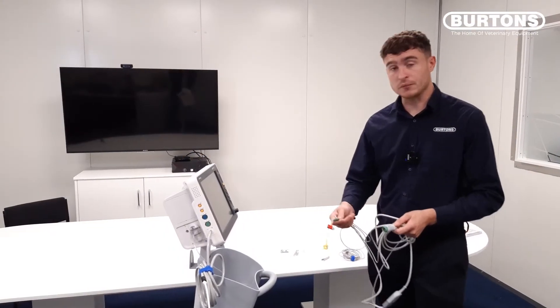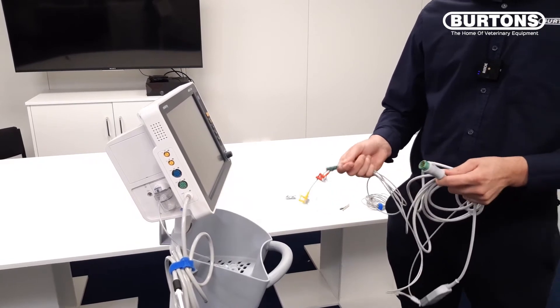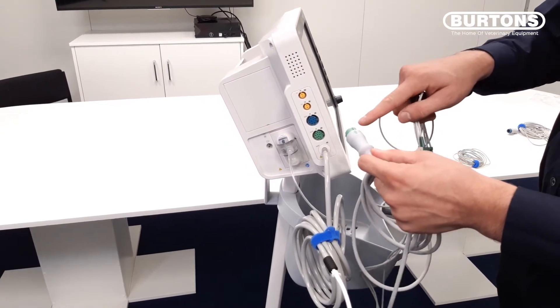As standard the UMEC comes with a 3-lead ECG cable, however a 5-lead cable is also available. To attach the accessory to the monitor, we simply make sure that the arrow is facing upright and insert it into the green port.